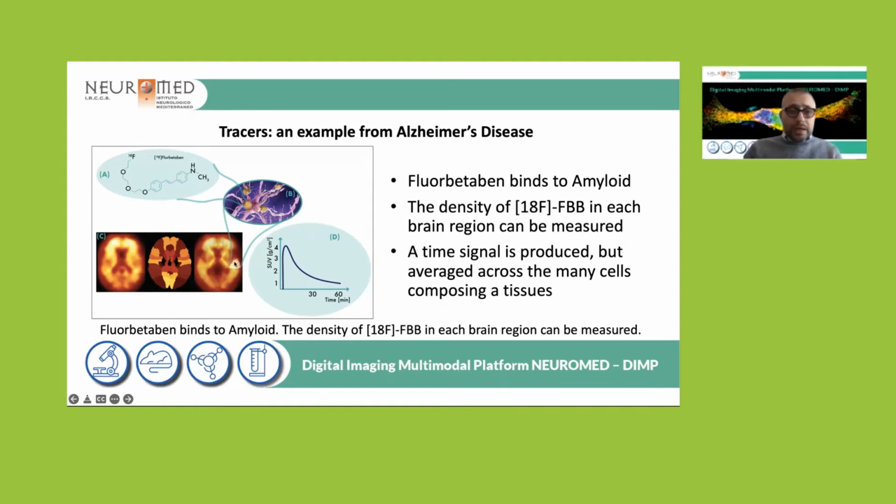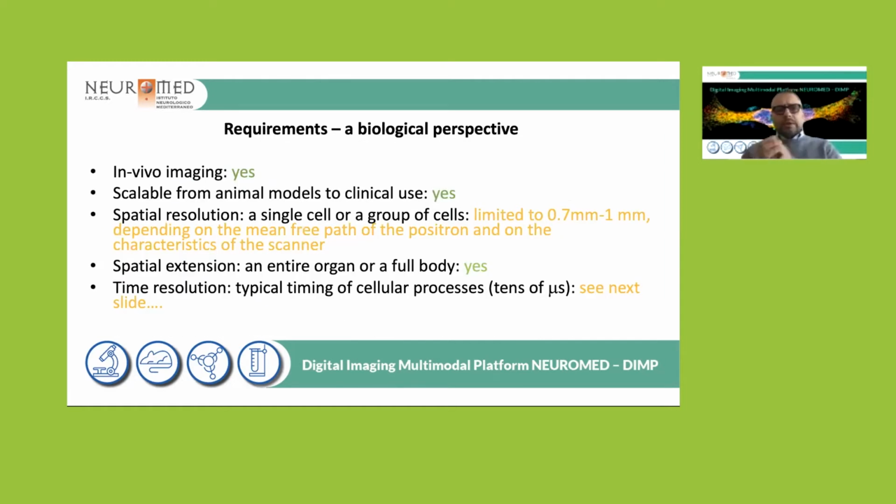Now, if you study each specific region in the brain, you can study the uptake of this tracer. So you can study in time how this uptake is changing. A time signal is then produced. However, although it may look like our initial promise, you see already it averages across many cells composing a tissue. So this example may bring me back to the requirements we had from a biological perspective.